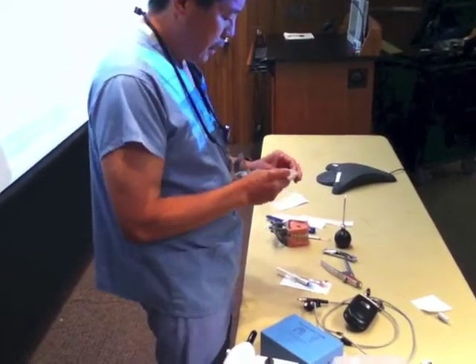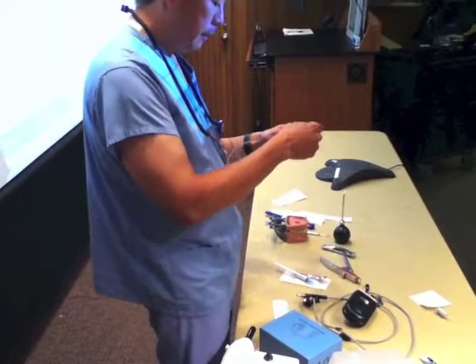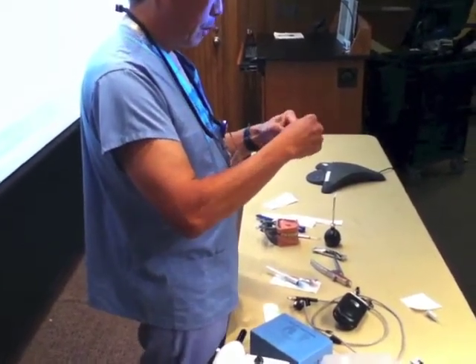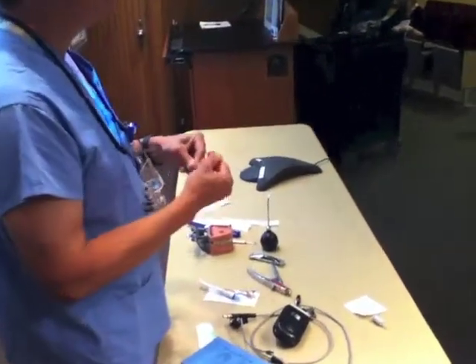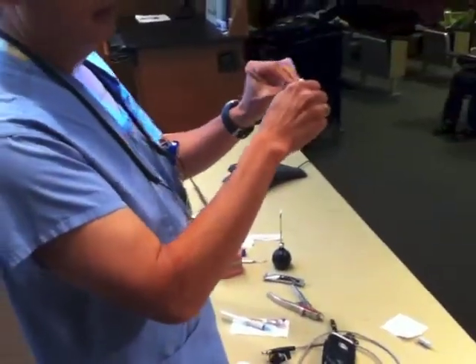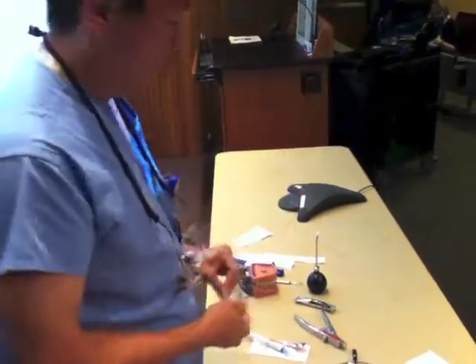We can use a nylon suture. All you have to do is grab it and twist it, as long as it's doubled. You can grab it with a hemostat and twist, or use two hemostats — twist it from both ends and then just hold it there.